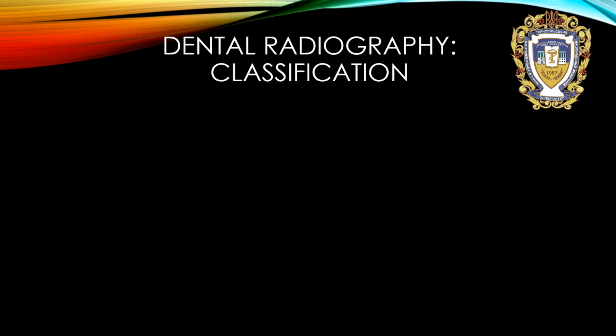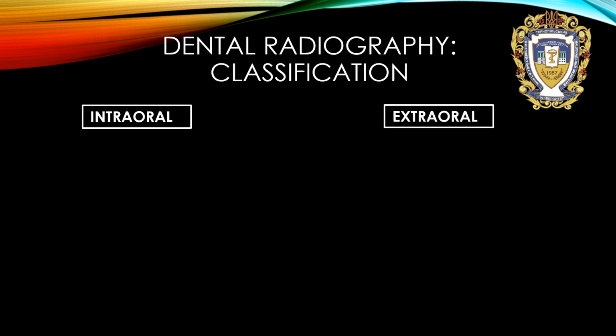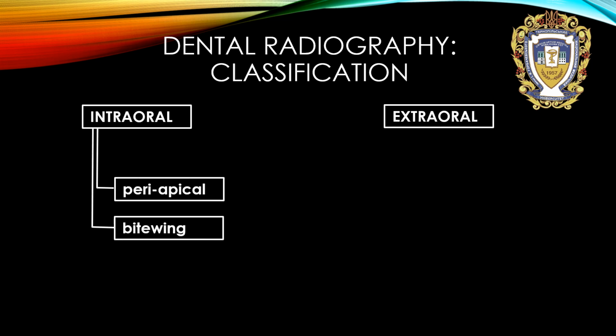Classification of dental radiography. As I told earlier, all dental radiographs are divided into intraoral and extraoral. Intraoral X-rays are divided into periapical, bitewing, and occlusal.